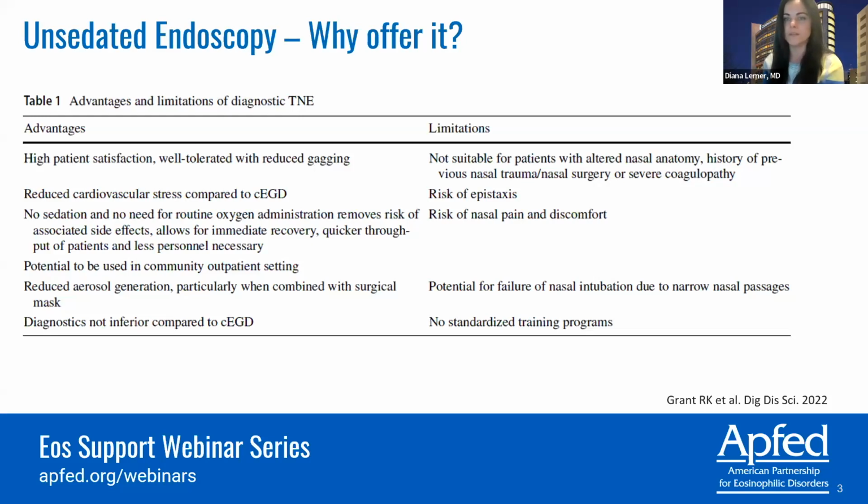And in the studies recently done, it shows that biopsy sampling is not inferior compared to the sedated endoscopy method. The limitations are really rare. It's not suitable for patients with significantly altered nasal anatomy, high risk of epistaxis, or patients who have a poor tolerance for nasal pain or discomfort.